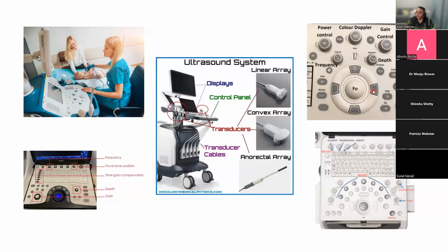However, if you want to set things manually, what you might be able to do is just select your transducer. A good example is if we're using the convex, which is usually a C85, which indicates a frequency of 5 to 8. Rather than using a preset, I will select transducer, and this will select the C85, but it will allow me to then select the frequency between 5 and 8 in three quadrants. So you have centiles of 25, 50, and 75 to 100, which means the maximum frequency that I can select is 8. There will be an in-between frequency that might be 6, and maybe a frequency that defaults back to 4.